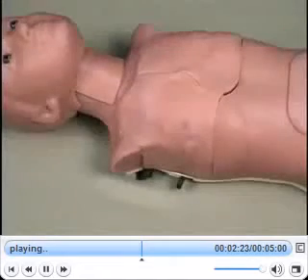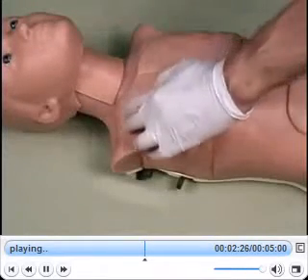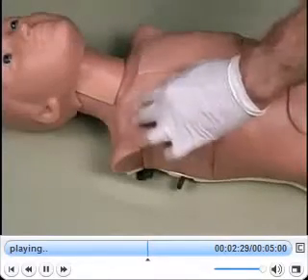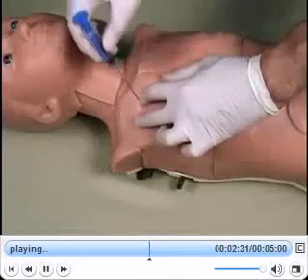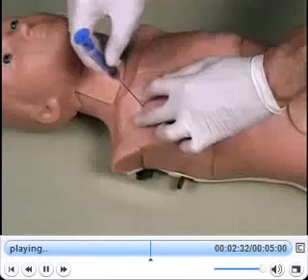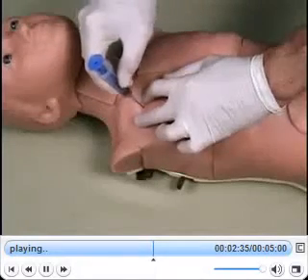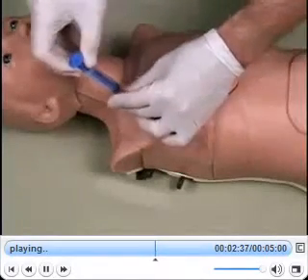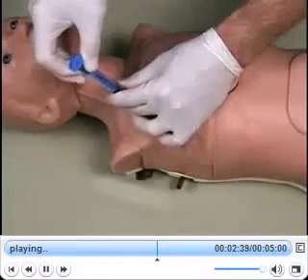The next procedure is the needle decompression. Begin by identifying the second intercostal space in the midclavicular line on the right side of the torso. The pressurized replacement air bladder creates a realistic rush of air that can both be heard and seen when the needle is inserted.